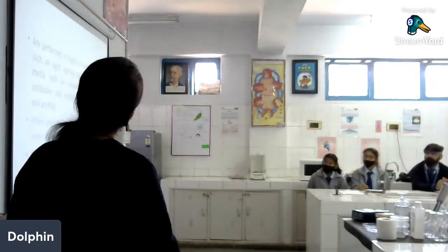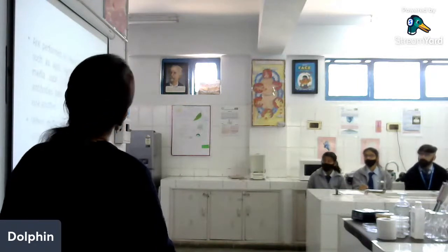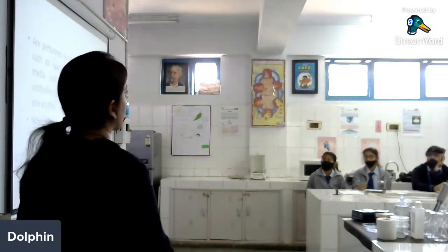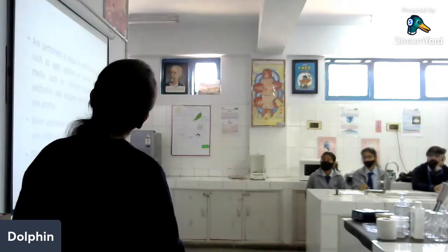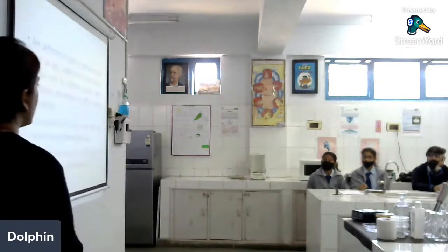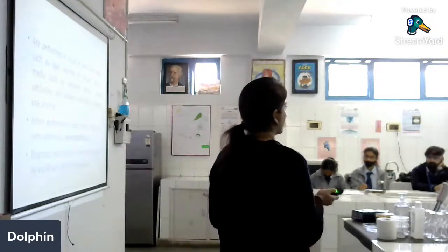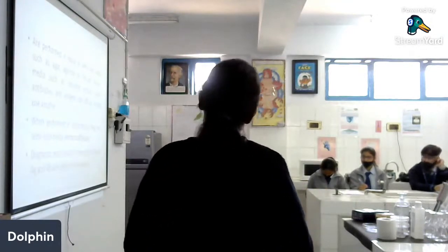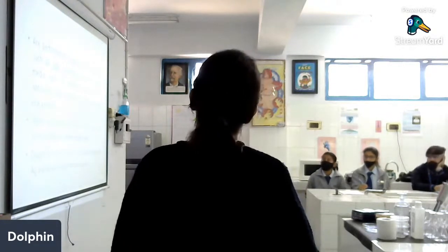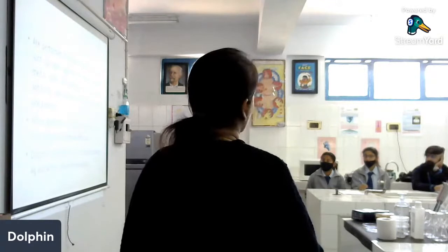So you can use liquid media. When we use liquid media, we mostly call it ring test, or the flocculation test also comes under this. Or we can use a semi-solid media like gel, or a non-gel support medium. Now, when we perform these reactions in semi-solid media, we specifically call it immunodiffusion. That is diffusion of antigens and antibodies. Immuno means antigens and antibodies. They are diffusing, they are interacting, they are forming the precipitate. These precipitation reactions, when they are used in vitro for diagnostic tests, we also call them immunodiffusion.